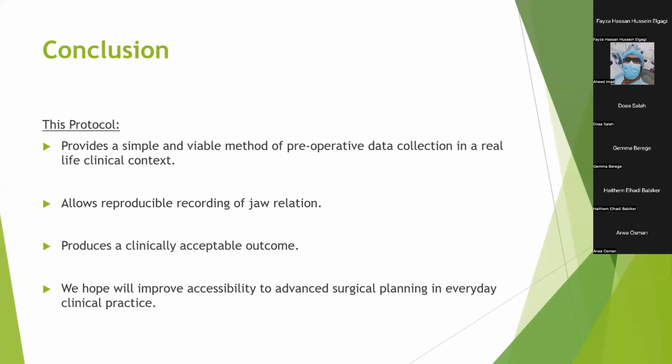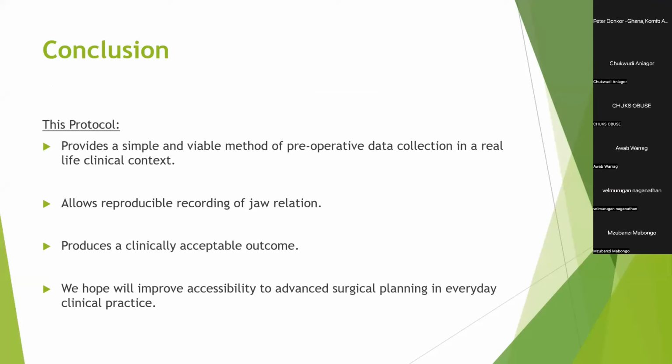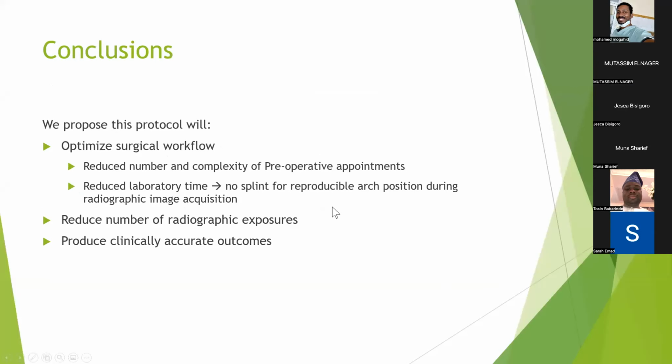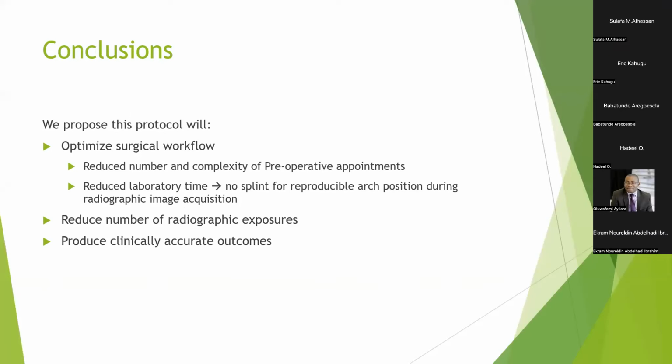So this protocol provided a simple and viable method of data collection. We found that it allowed reproducible recording of jaw relations, a clinically acceptable outcome, and VSP, due to accessibility, may well be the way of the future for orthognathic surgery. But it doesn't, again, stop the need for in-depth planning that we need to do ourselves.